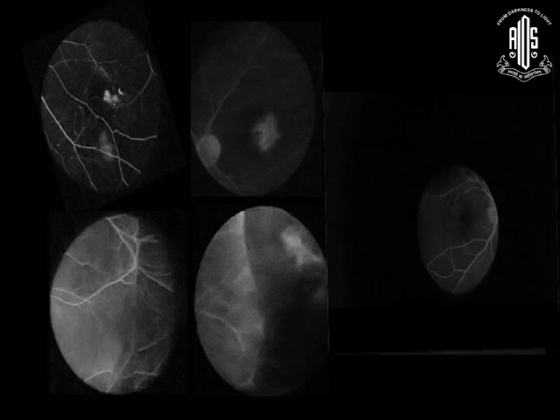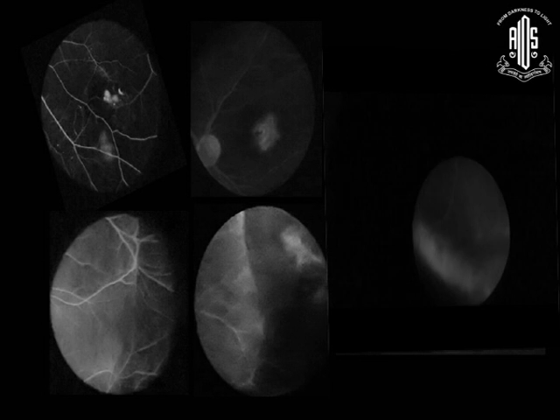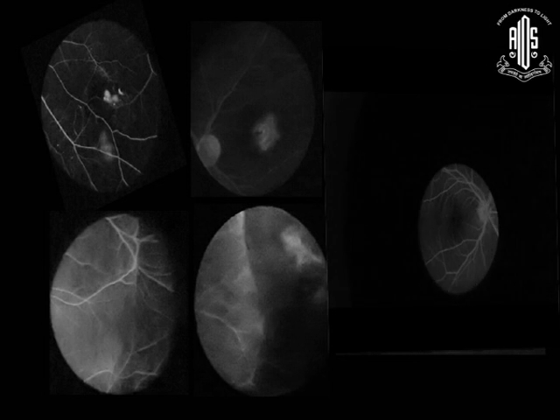CME is there. But I made him lie down and did a scleral depression and an angiography of the far periphery. And then I found there is a straightening of vessels, there is a large area of avascular retina, mid-peripheral abnormalities here, and neovascularization in the periphery. This is when he is supine, lying down, and I am doing a scleral depression, and there's cystoid macular edema. And that is the area. You can see my depressor coming in here, that's the avascular zone. And there are areas of neovascularization in the periphery. It is not an easy technique, believe me, it's very tough.